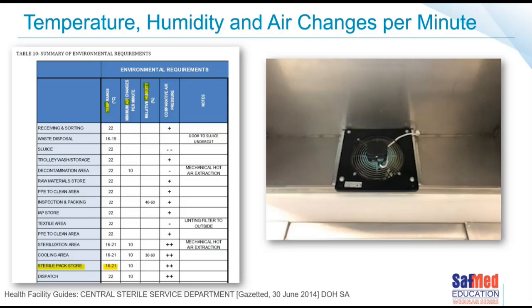Some areas, thankfully, have got separate linen areas or linen folding areas, as many of our CSSDs do still use traditional cotton linen as patient drapes. And if you could do that, all that folding of linen in a separate area, that would be better. Of course, then the lint is out the way and it doesn't affect our air conditioning.